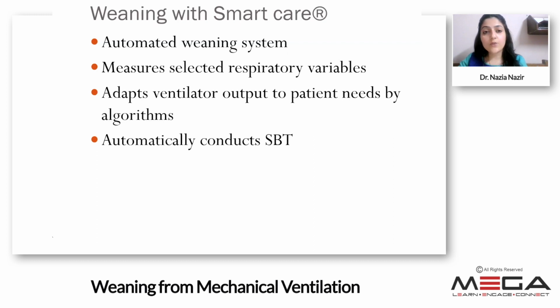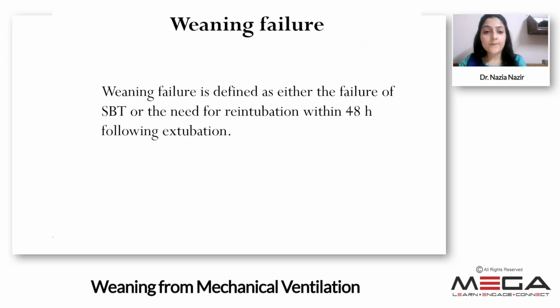Similar to this automated weaning is the use of the SmartCare weaning method, which is seen in the Drager ventilators. It is again an automated weaning system. It measures the selected respiratory variables and then adapts the ventilator output to the patient's need by a predefined algorithm, and also automatically conducts the spontaneous breathing trials.